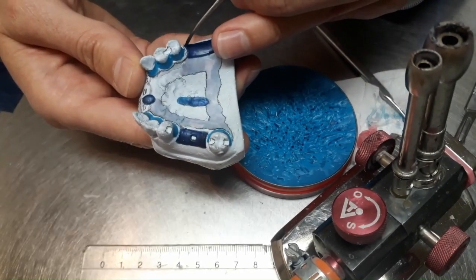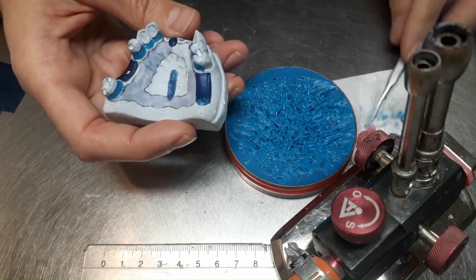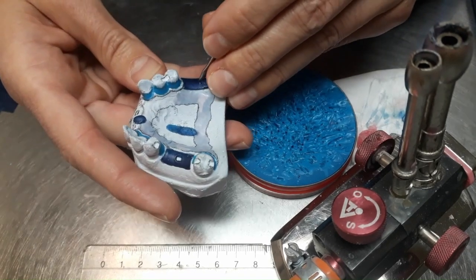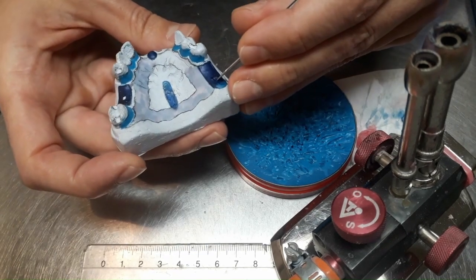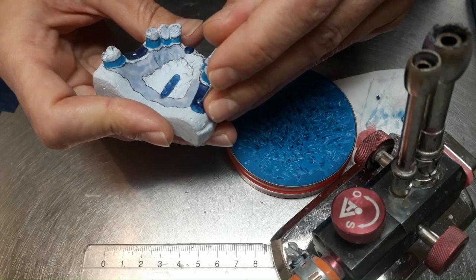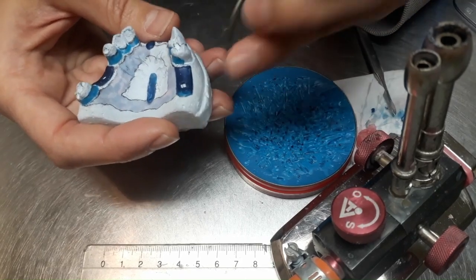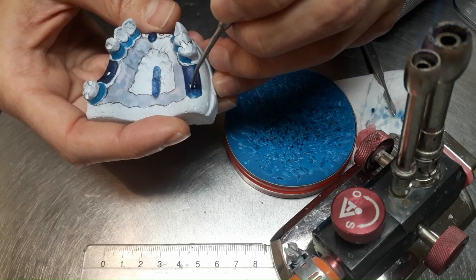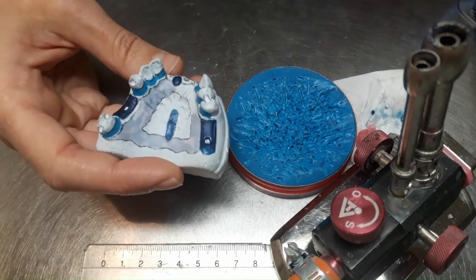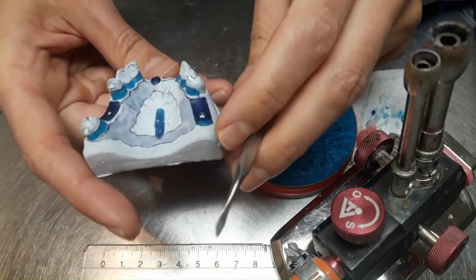So here, on the distal part of the remaining teeth, and on the terminal region, we want to have a metal rest. So we cut actually the wax, and we will allow the metal to touch the plaster of the model. Why? Because I want to make sure that the metal, once placed in position, does not have any balance movement. So here also on the inside we have to glue the wax to our model, so to say. But you see there the metal will have a pin. Now you see the margins that I want to give to my framework.